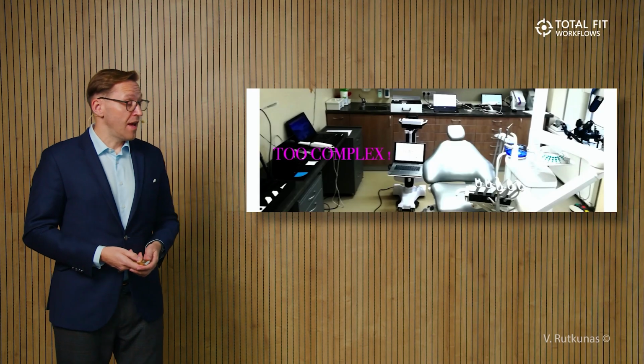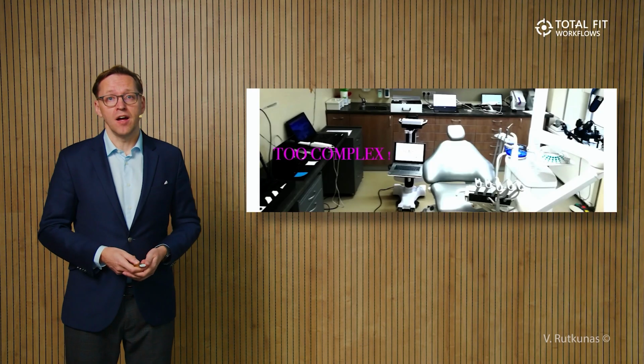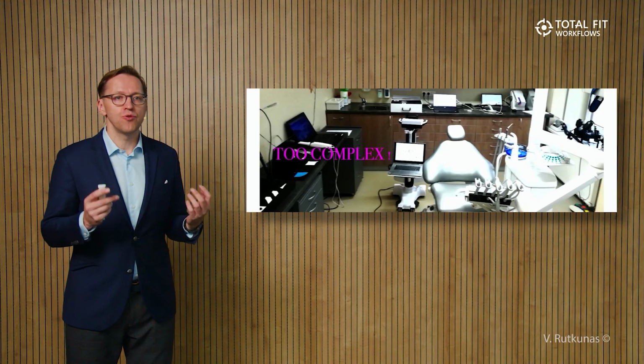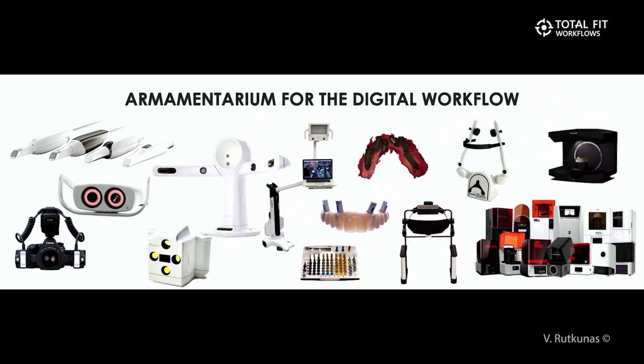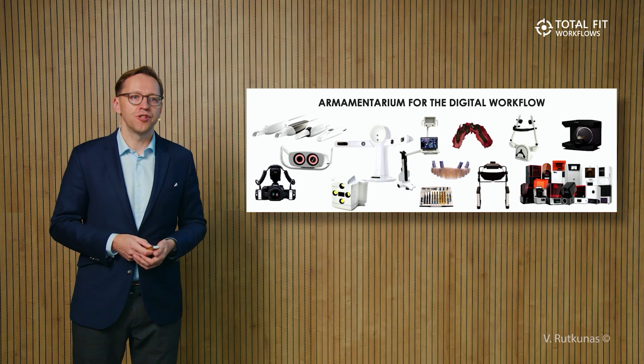Going to the dental chair, the digital workflow sometimes is too complex. We have so many devices. Look at the armamentarium for the digital workflow. Intraoral scanners, photogrammetry devices, face scanners, dynamic navigation, different sets for guided surgery, for scanning, scan bodies, jaw tracking devices, laboratory scanners, and 3D printers, and needless to say, digital camera.